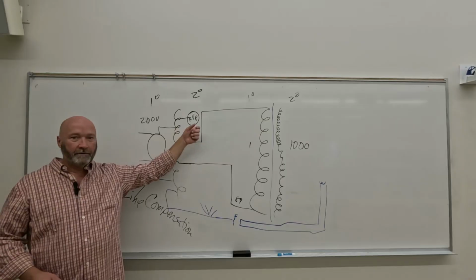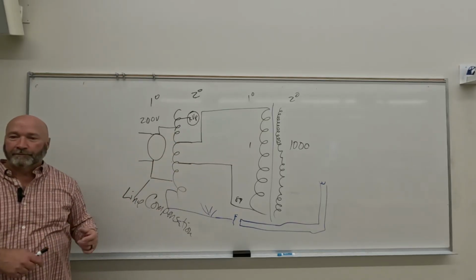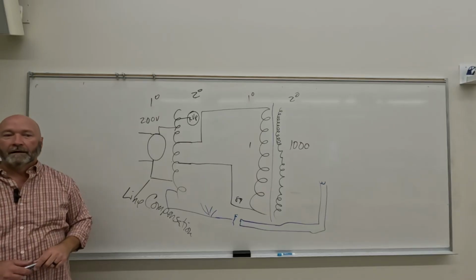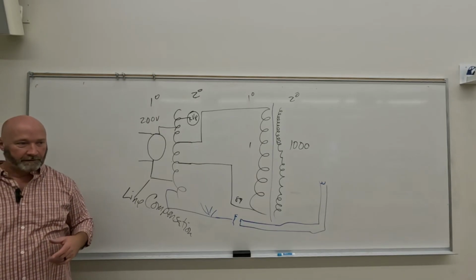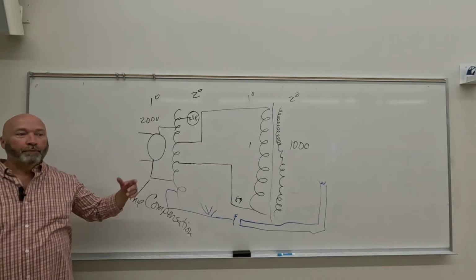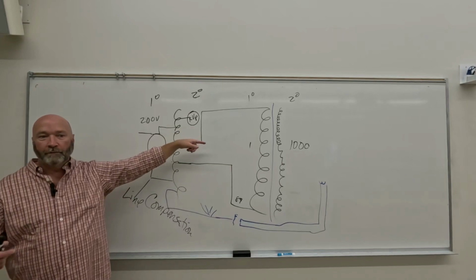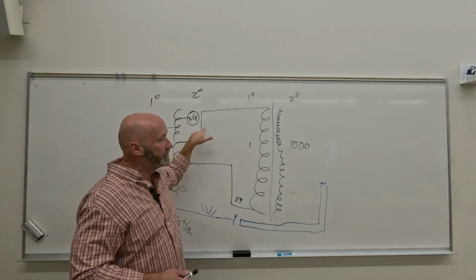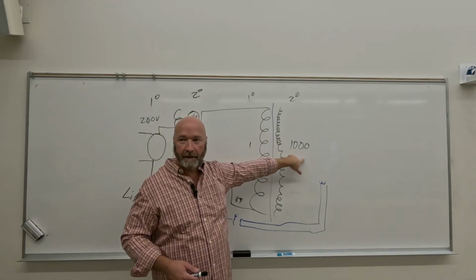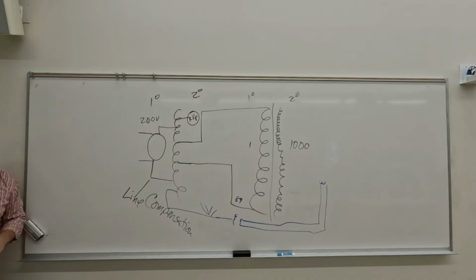We're going to call that, though, not just kVp meter, but what do you call something that comes before something else? Pre, yeah. So pre-K comes before kindergarten, right? So this is a pre-reading kVp meter. It's reading the voltage in anticipation of it becoming kVp, but it's not really kVp yet. It's a pre-reading kVp meter. Okay?